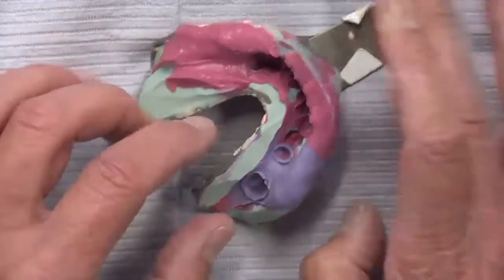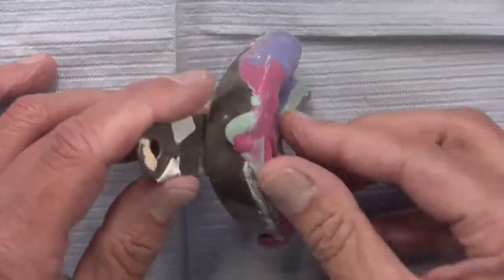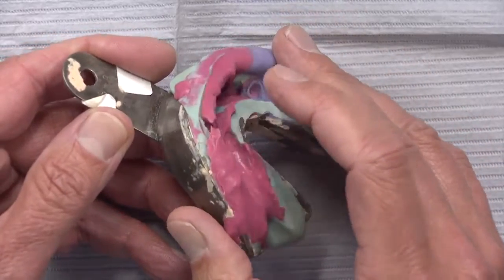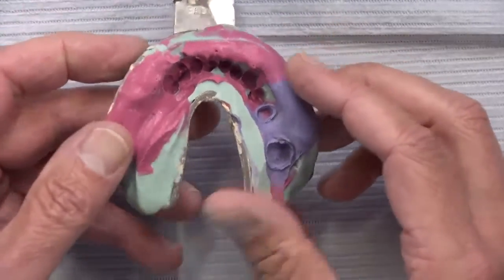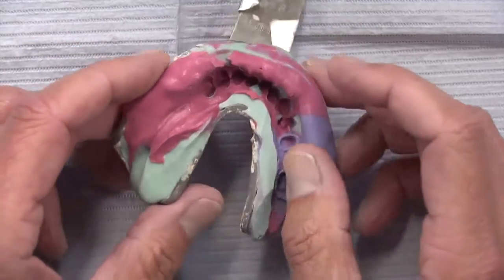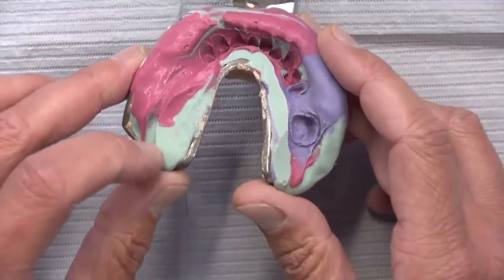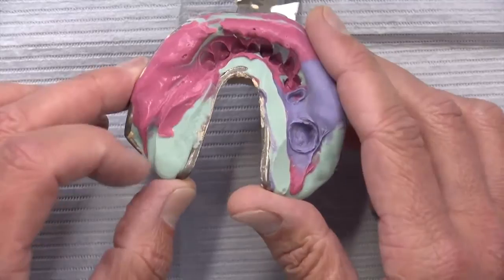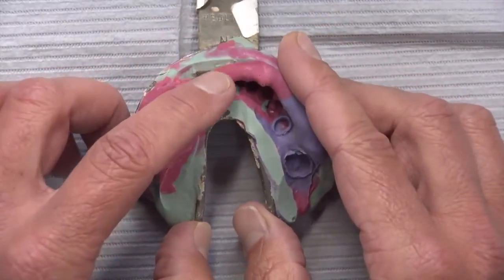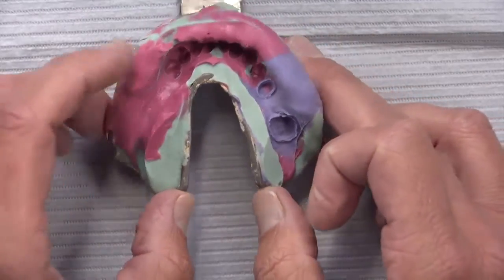One of the signs that you can tell this was done in 2 phases is that the materials will separate from each other rather easily. If this was done as a simultaneous impression, these 2 materials will always stick together. They will not be able to be pulled apart like this. In other words, when you syringe material around the tooth and your assistant's putting material in the tray, and then you seat the tray material onto the syringe material and they set simultaneously, they will not peel apart like this. And that's the technique that I use and we like as a laboratory.